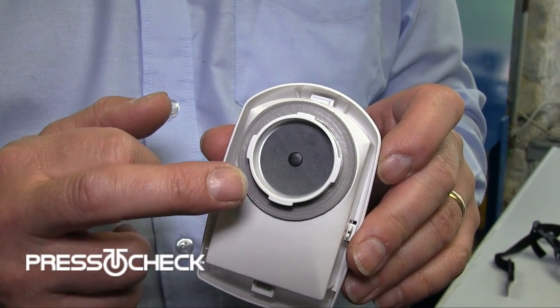On every filter that you get with the Force 8 mask, there is a gasket and a diaphragm. They're part of the filter.